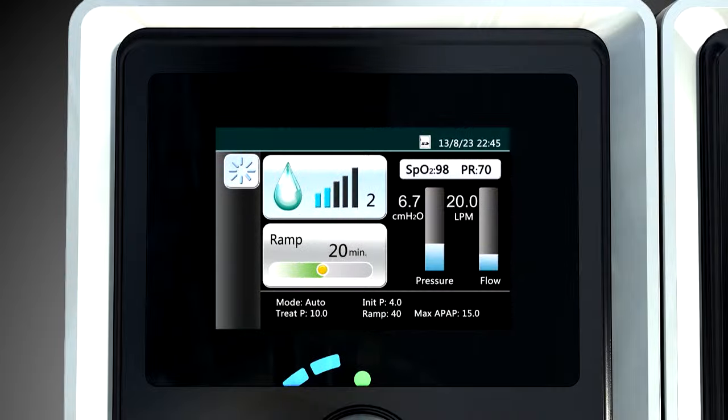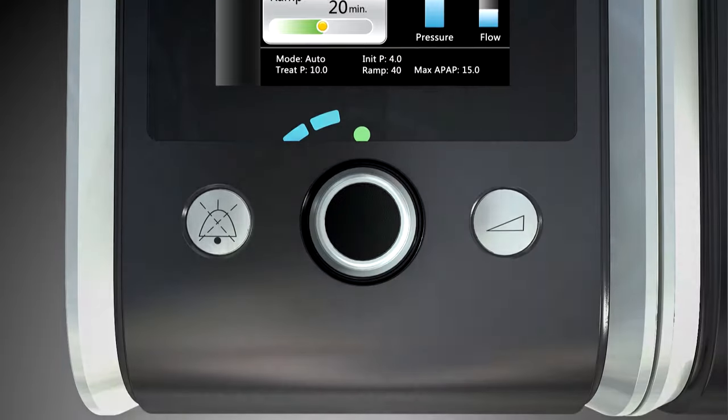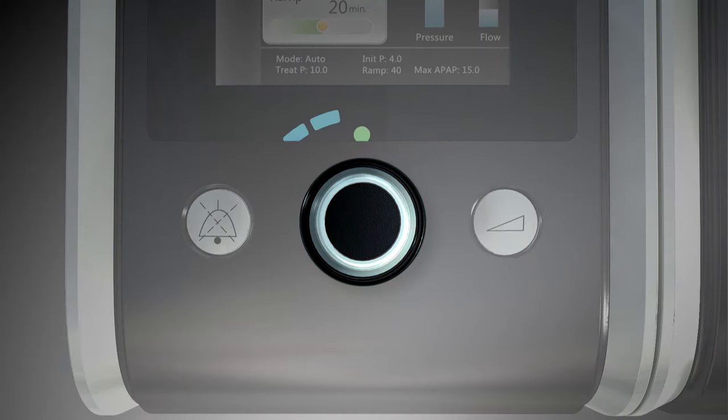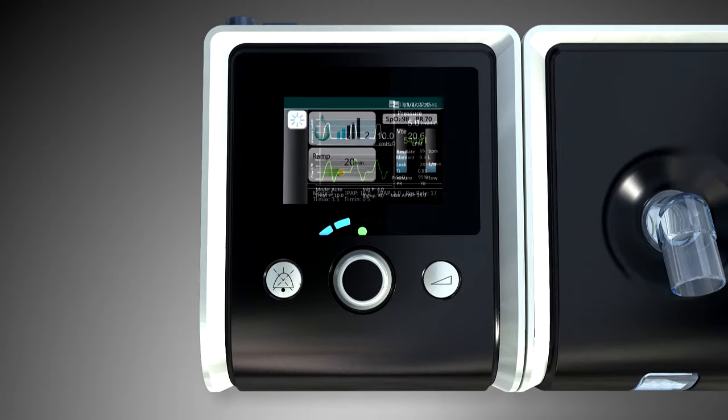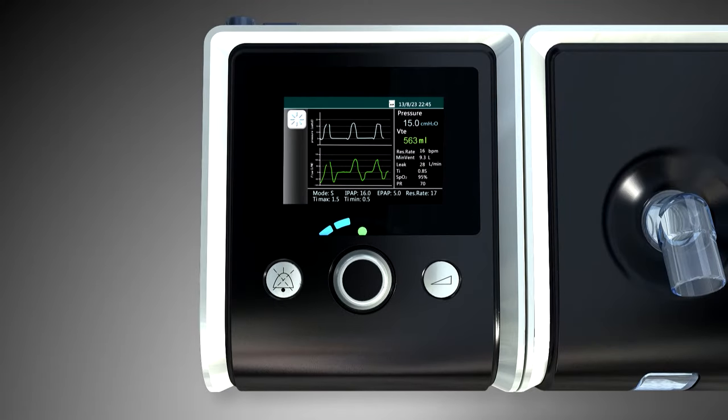With a 3.5-inch color LCD display and exquisite control knob, the BMC ReSmart Generation 2 series brings you an unsurpassed operational experience. Real-time flow wave connects us to better patient care and compliance.